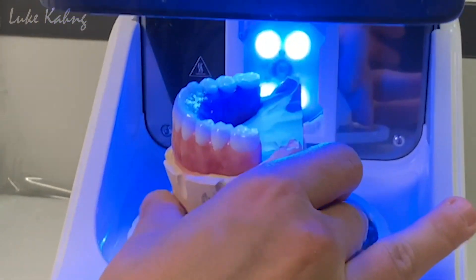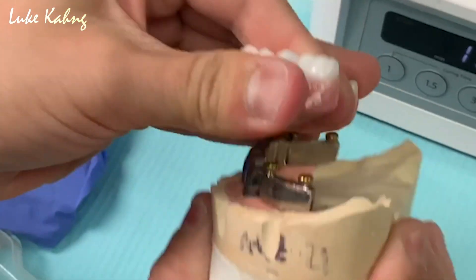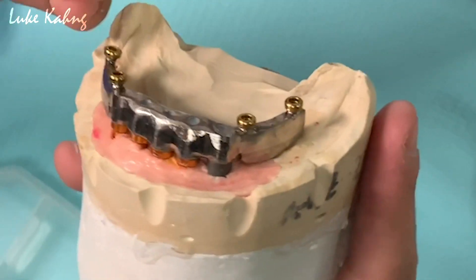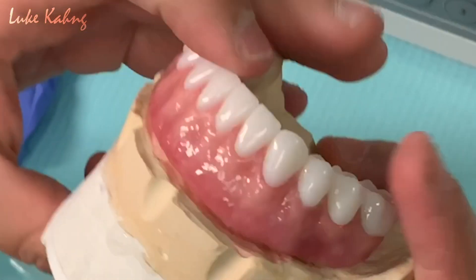After curing, check once more that the locator fits onto the hybrid bar. It should be able to fit with a snap.